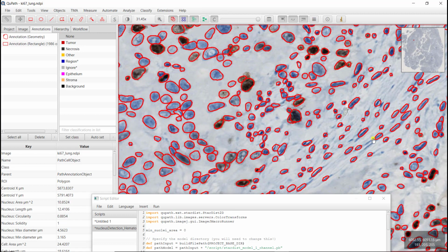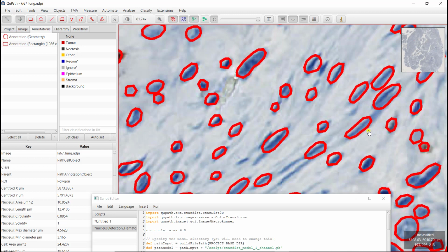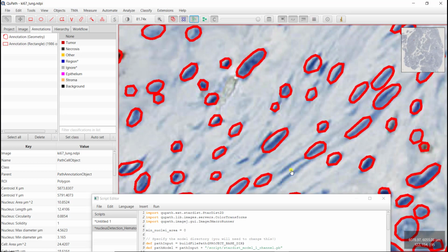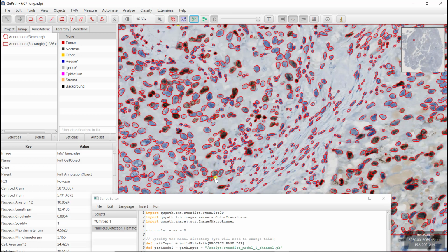Now, when we have very elongated cells, it might be a problem, mainly because I don't think that in my training data set I had elongated shapes, which is basically just a rod. We can see when we have these kind of things, it's able to segment it, but not as a long elongated shape, but more something a little bit larger. You see? So probably I won't be able to obtain them with the model I have because of the data I used for training. I'm just going to increase this to 10, so I'm going to get rid of the small ones.